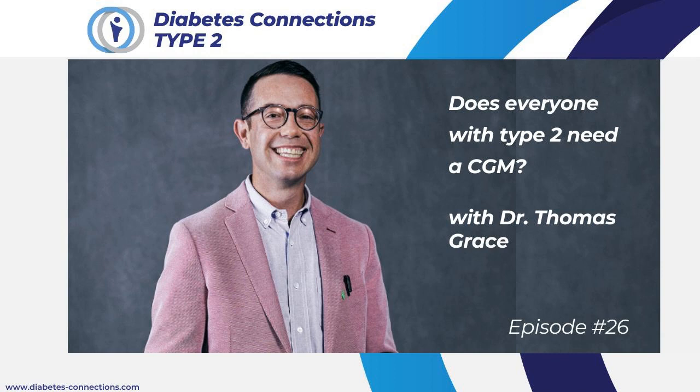Yeah, excellent question. And I was just asked this at ATTD as well. Is this something that is a temporary therapeutic, or is this something that we need long term? And I can say with great confidence out of my personal experience that it's out of sight, out of mind. Patients tend to not pay as close attention when they don't have the data being fed to them continuously. And sad but true story, I've had patients that have done so well using a continuous glucose monitor that they've gotten off of all therapies, all medications.